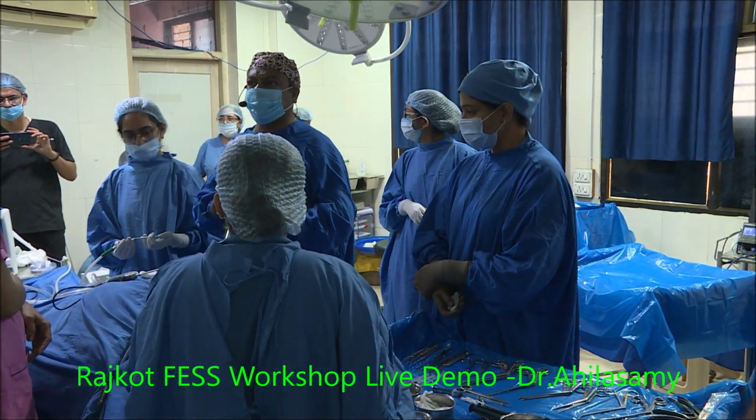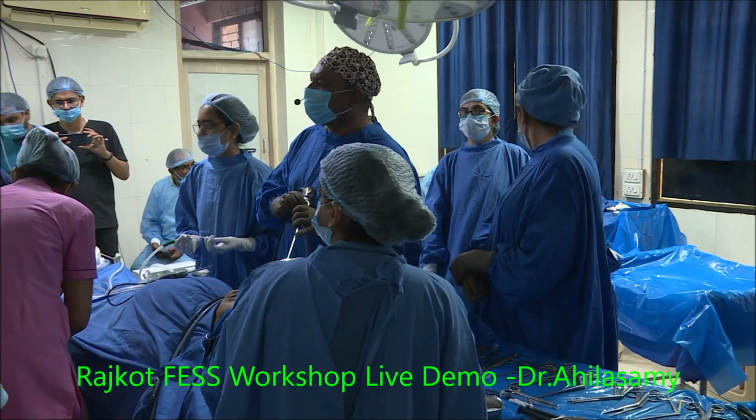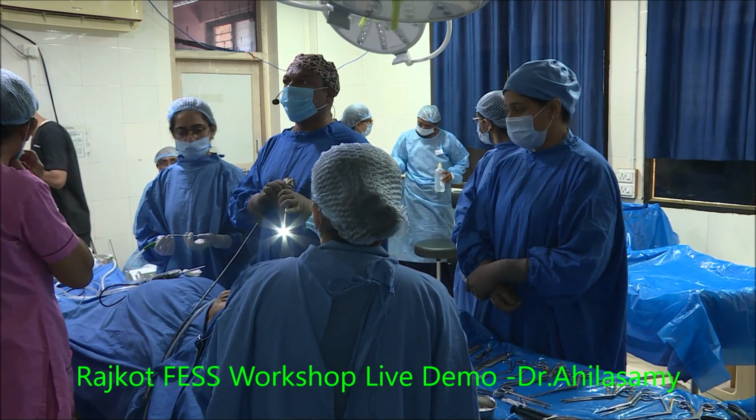Okay, the patient is draped. It's a 74-year-old man. Now the pulse is around 64. BP is around 130 by 73.